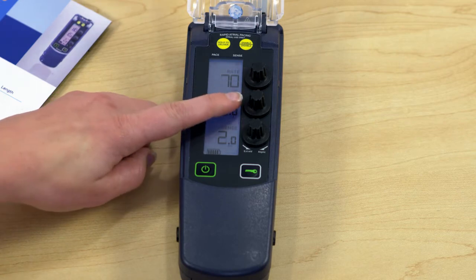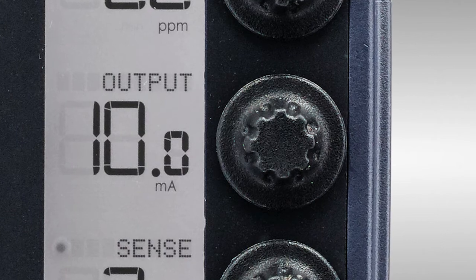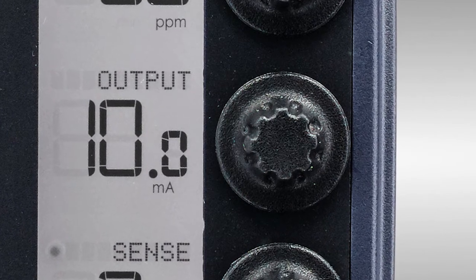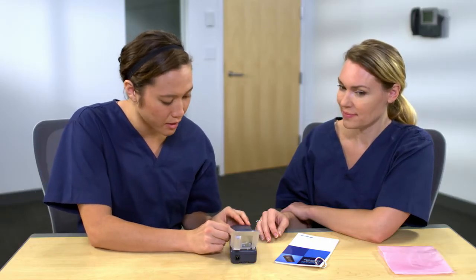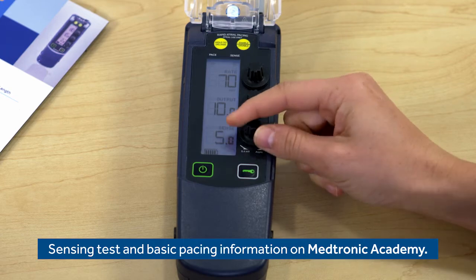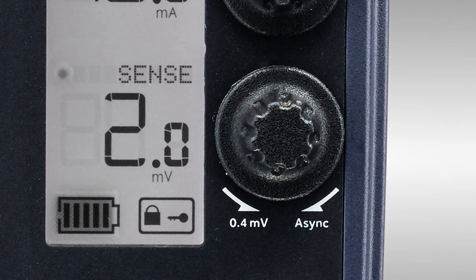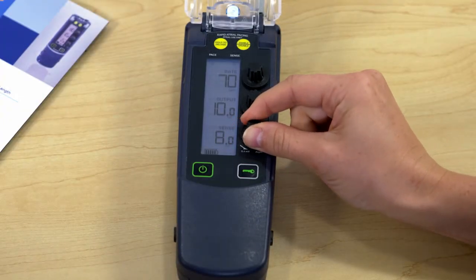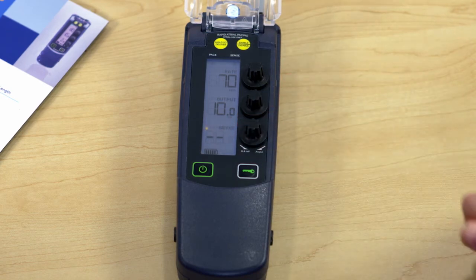Next is the output knob. This controls how much energy is used for each paced beat, measured in milliamps — this is a constant current device with output in milliamps. Clockwise is for higher numbers and counterclockwise for lower, and it's the same for sensing. Remember, for sensing, the higher the number the less sensitive it is. The range is from 0.4 millivolts to asynchronous — just by turning the knob you can go to asynchronous pacing.